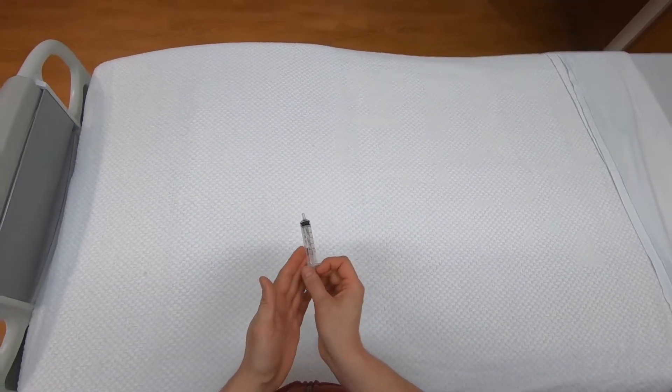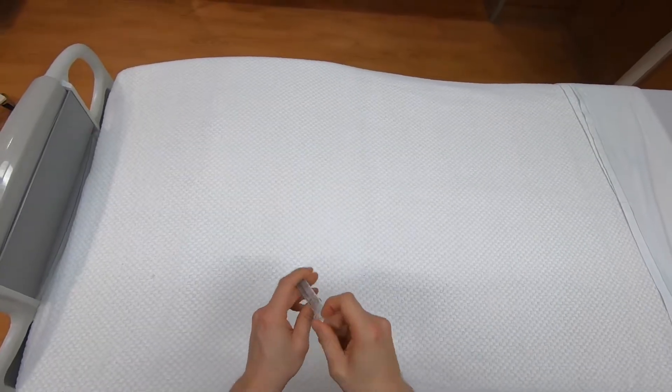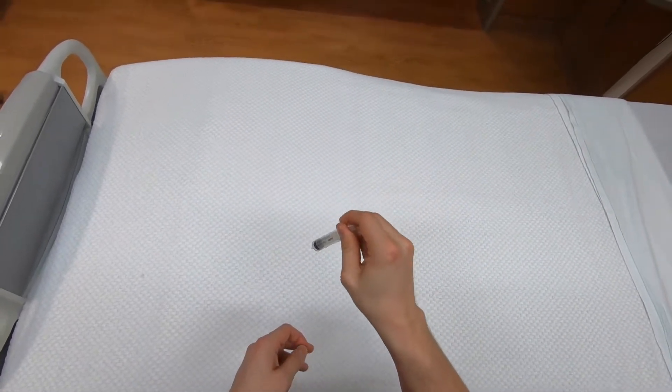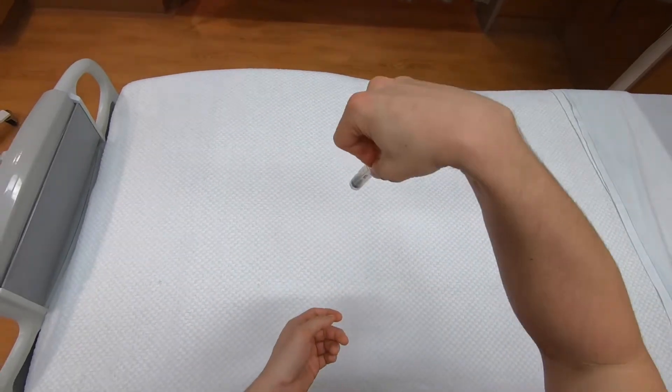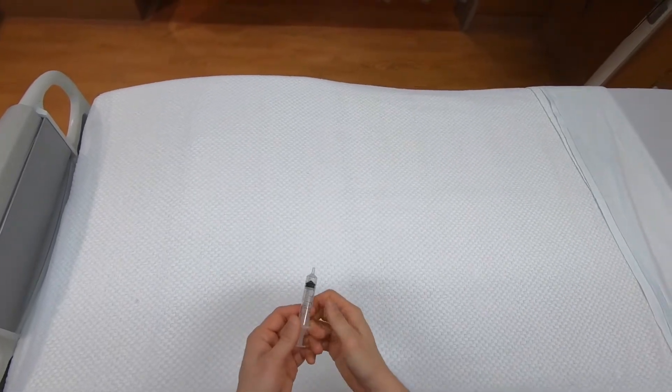I find these two grips are useful at different times. If you have a very shallow approach, such as for an IJ, pressing with your thumb is most convenient. If you're approaching more acutely, such as for a deeper vessel like a subclavian or femoral, you may want to press with your index finger because it's much easier to get your hand up here.